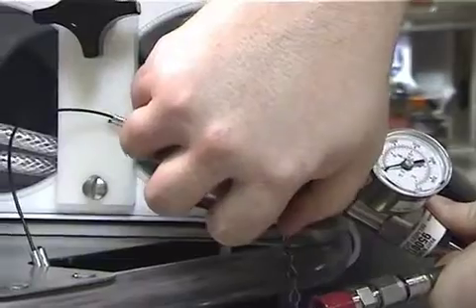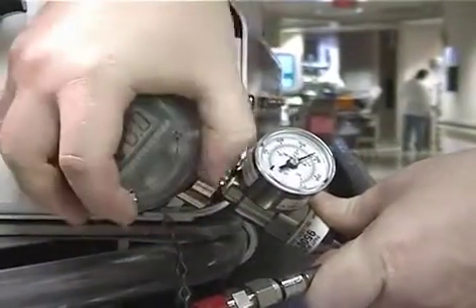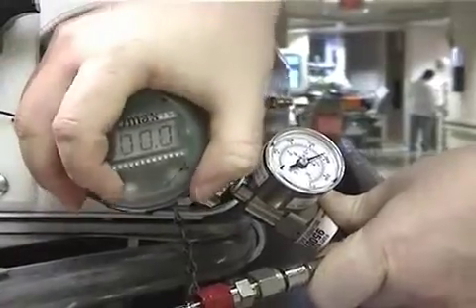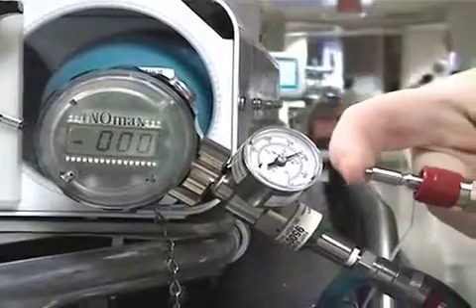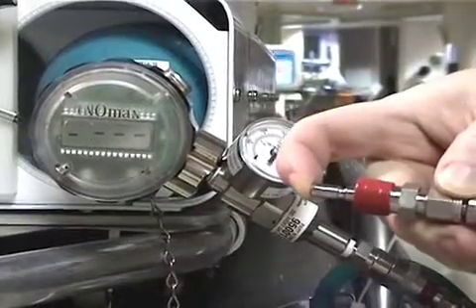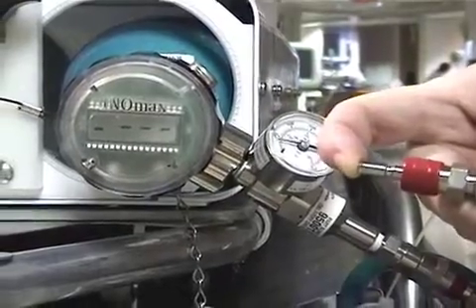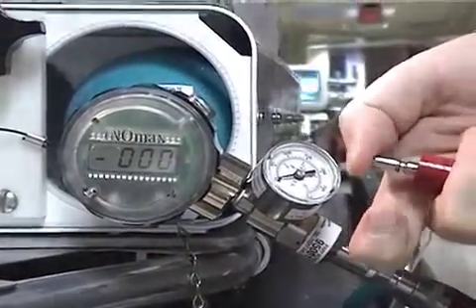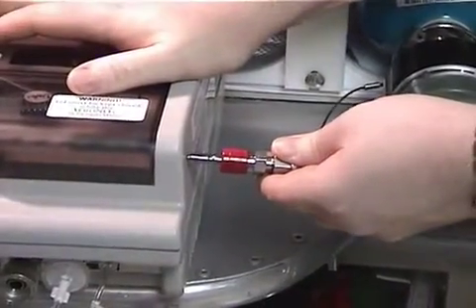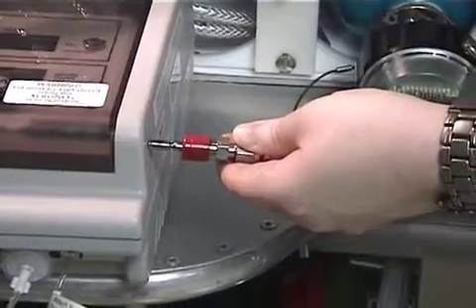You will then need to power the cylinder and regulator and then turn it off. This is to ensure that the system pressurizes. You will then depressurize the system by pressing the opposite end of the hose until the regulator drops to zero. You may find it more comfortable to depressurize the hose by pressing the tip against a flat, firm surface.